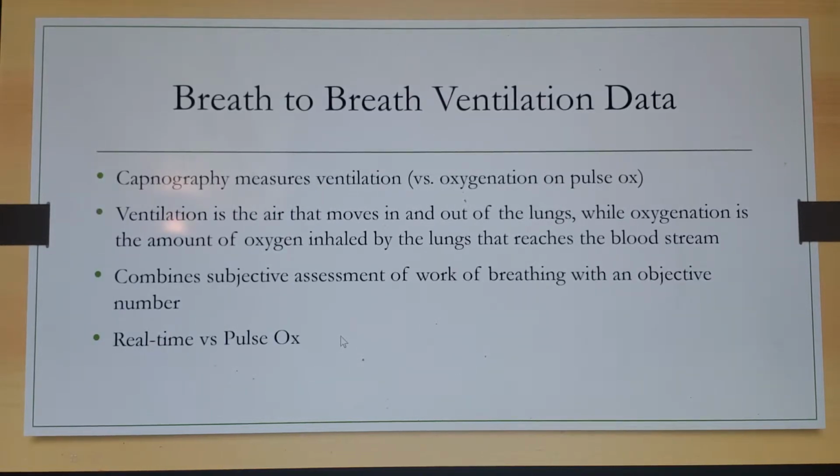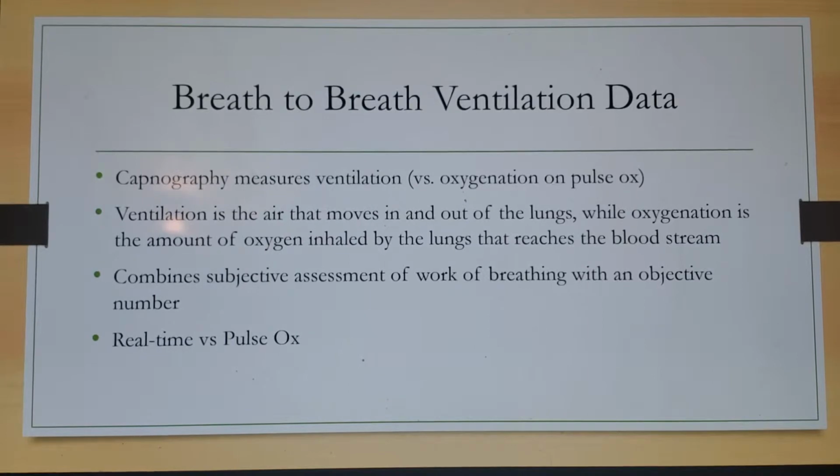And what's it tell you? It tells you some breath-to-breath ventilation data. Remember, capnography measures ventilation versus oxygenation when you're measuring on a pulse ox. Ventilation is the air that moves in and out of the lungs, while oxygenation is the amount of oxygen inhaled by the lungs that actually gets in the bloodstream. So when you're wanting to see absolute time-dependent breathing, ventilation is what tells you the most.